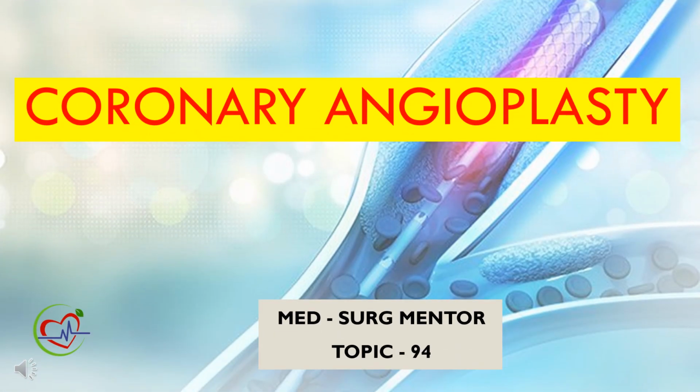Coronary angioplasty is a procedure used to open clogged coronary arteries. This procedure can improve symptoms of blocked arteries such as chest pain and shortness of breath.